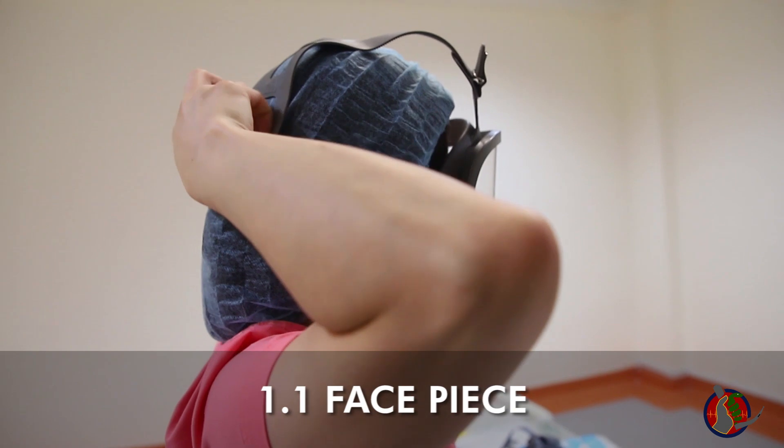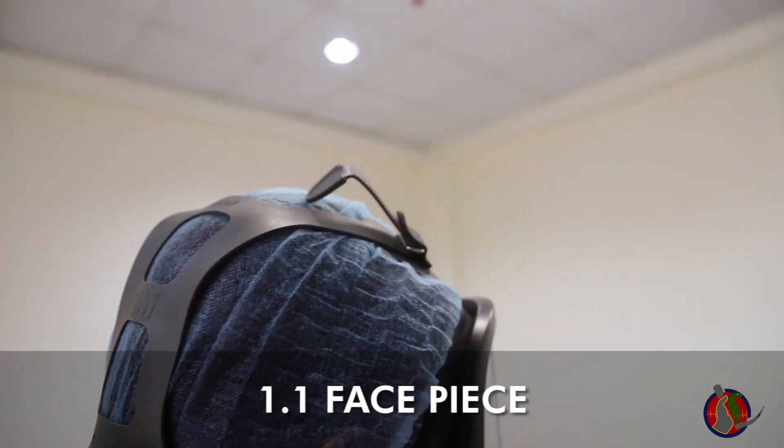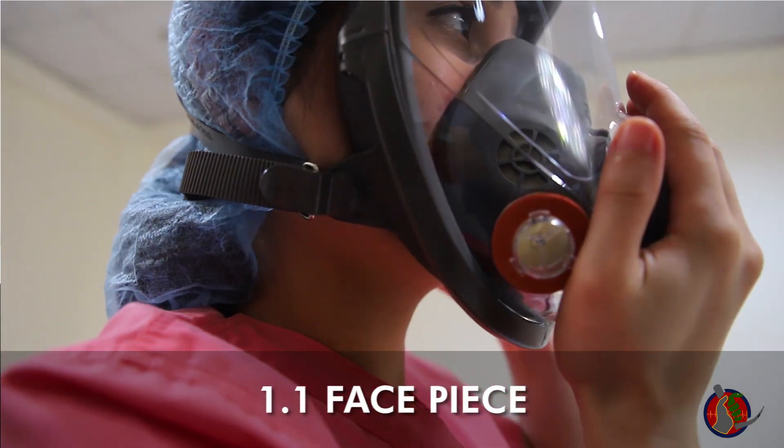Pull down the head of the harness to the back of your head, then lightly tighten the straps. Start with the bottom straps, then the top straps.